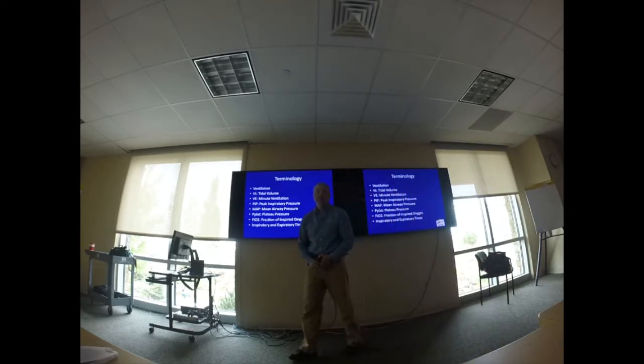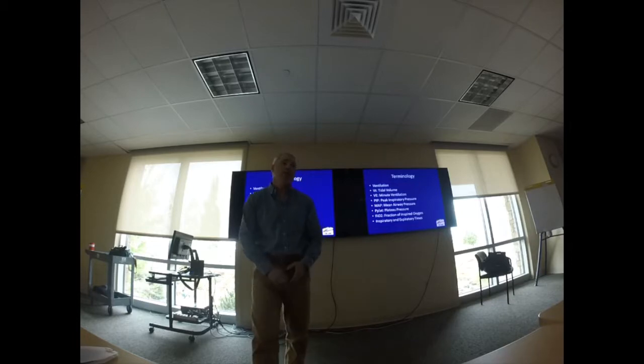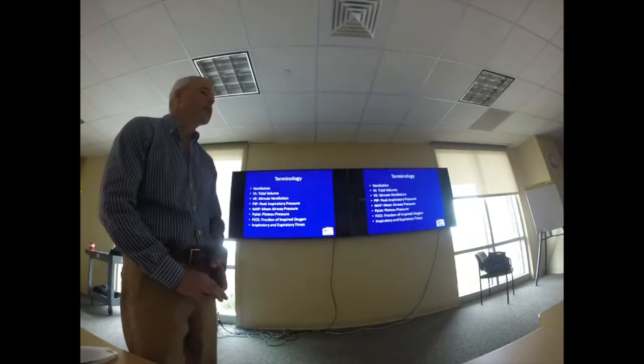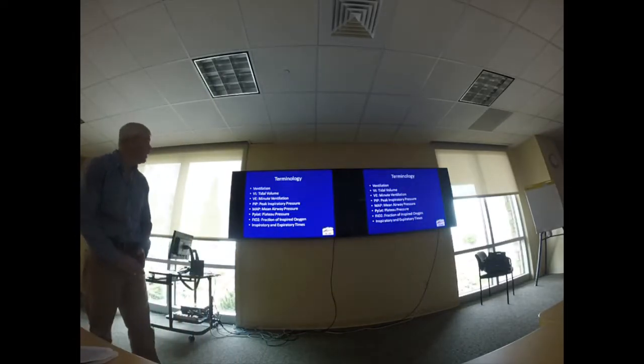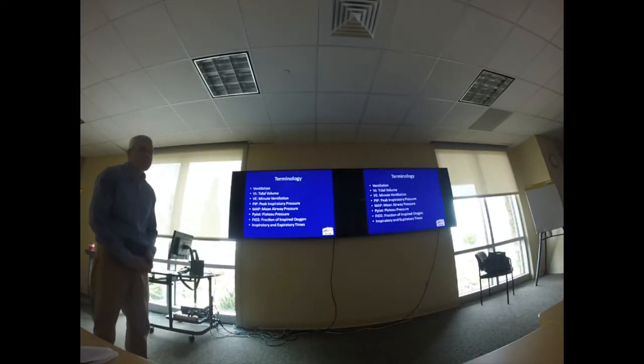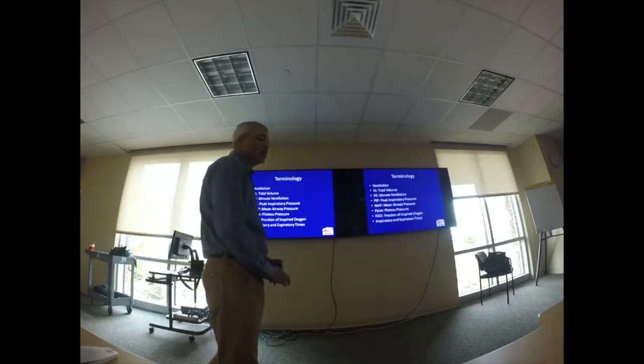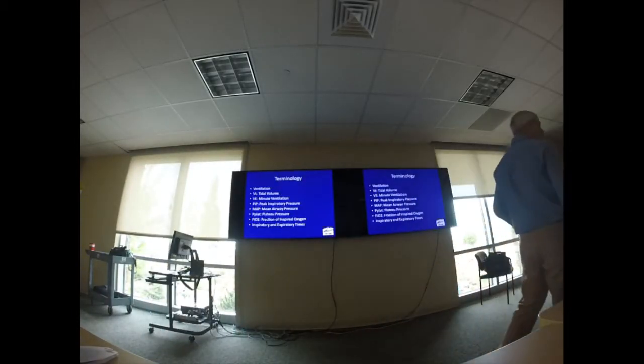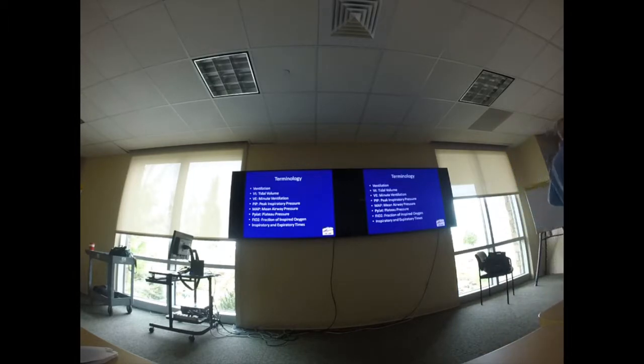What do you guys do today? What's a normal tidal volume for a patient? 6 to 8 cc's per kilogram is what you usually give to a person. And a tidal volume, you guys, is just the air on a normal inspiration that you would take right now. So it's not anything greater than that.